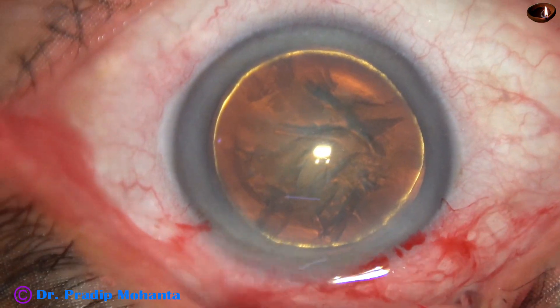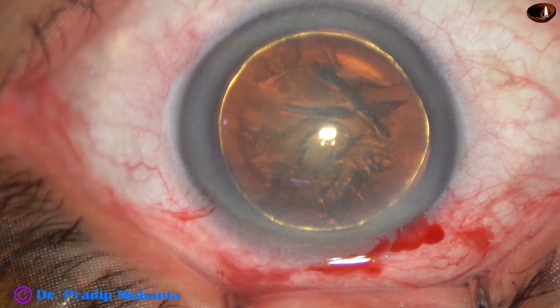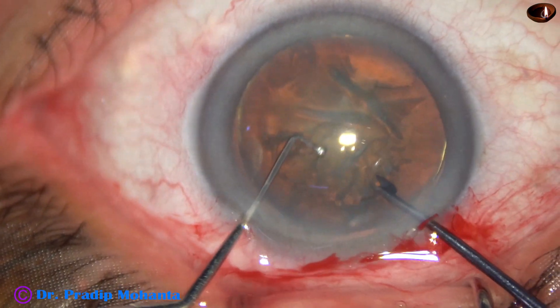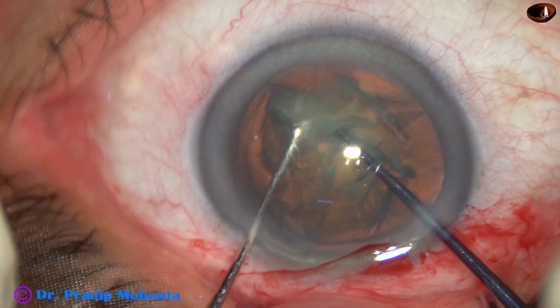Visco is injected again and now see the use of a pre-chopper for division of the nucleus. This pre-chopper has been designed by Dr. Sohail Irfan Khan of Nanded, Maharashtra, India.